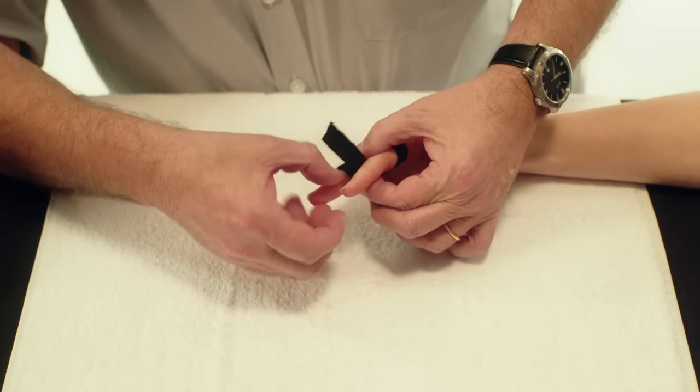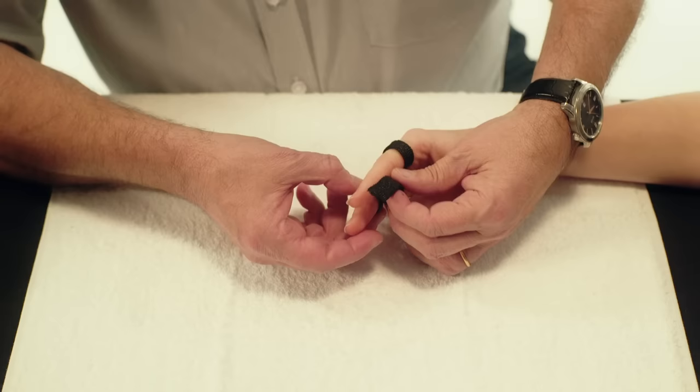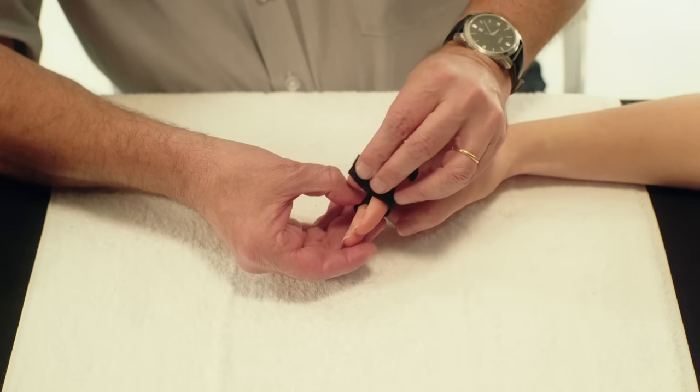Repeat the same for the second part of the orthosis, which rests over the middle phalanges, positioning it between the PIP and DIP joints.